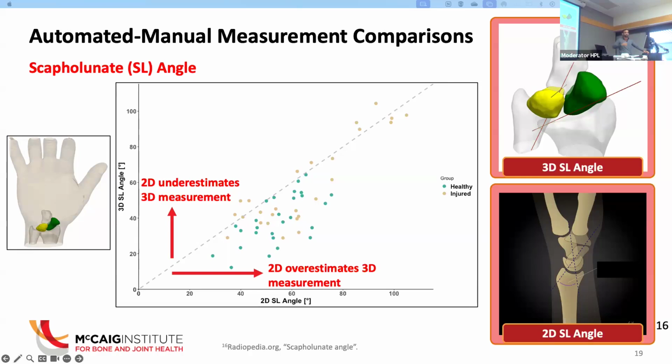There have been a couple of studies in recent years that have done some load bearing or mimicked load bearing, but it's generally been limited to just flexion extension and then ulnar deviation, radial deviation. Okay. I think you had a question back there?